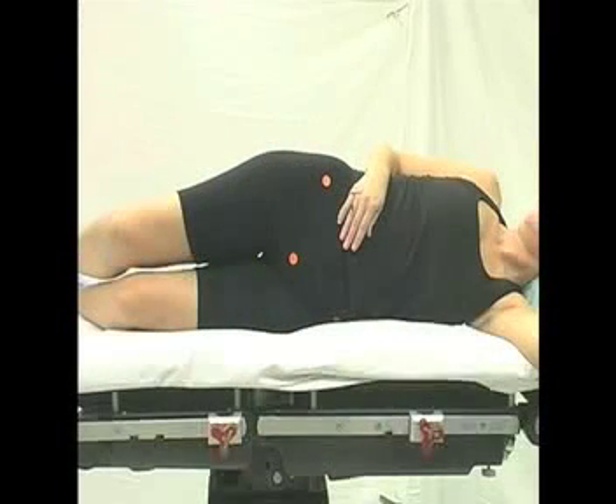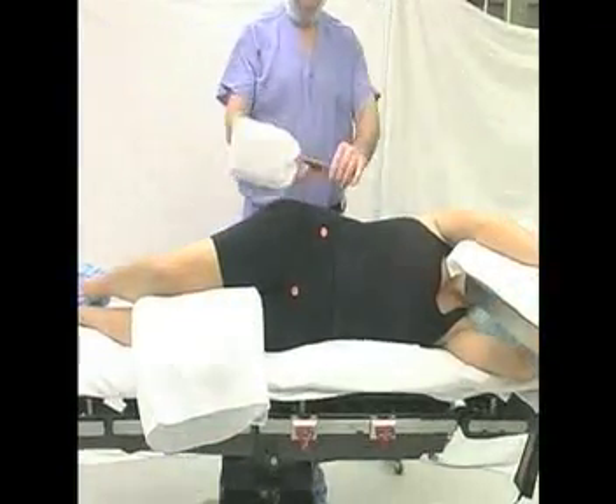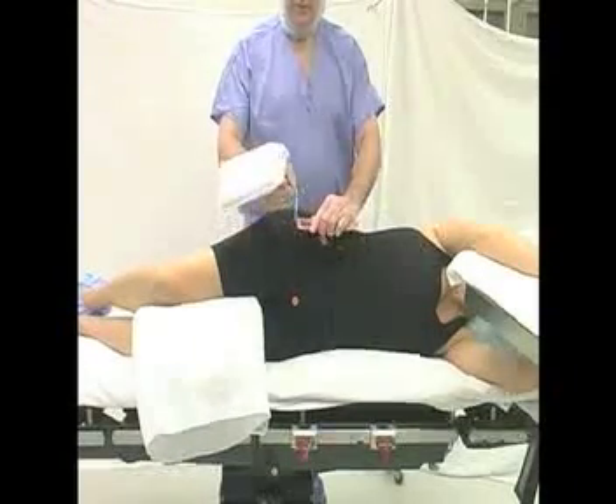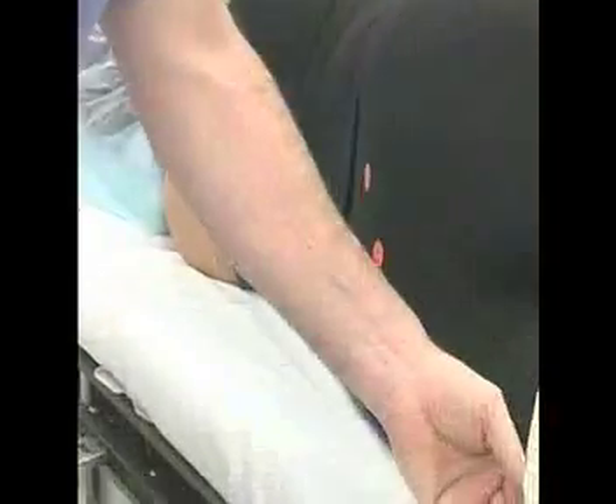The posterior chest support is positioned at the tip of the scapula. The anterior chest support is placed below the breast on the sternum. The abdomen remains unobstructed.